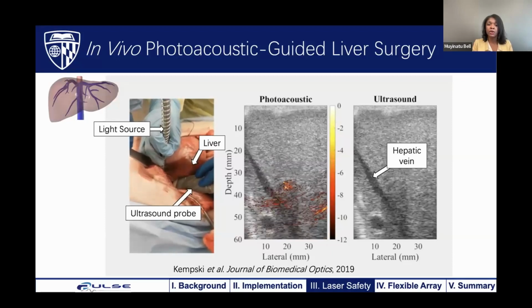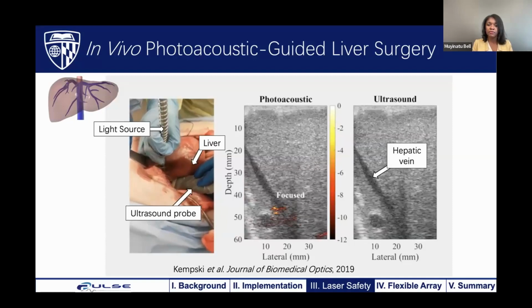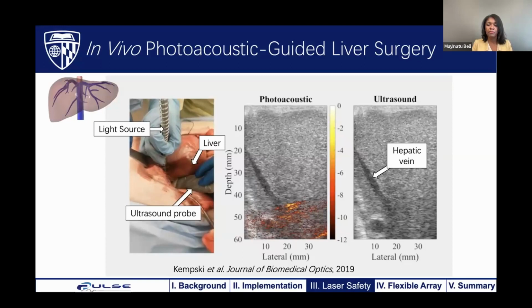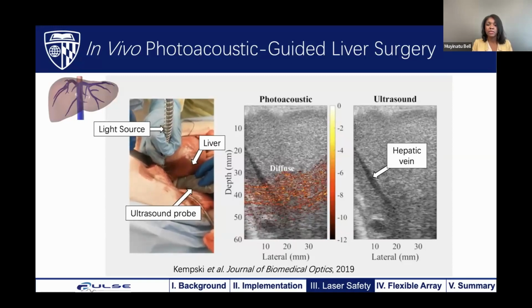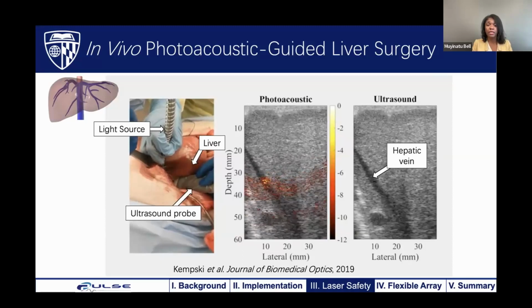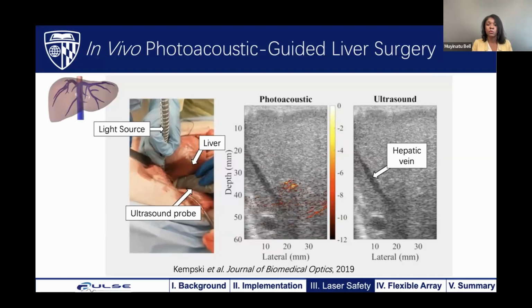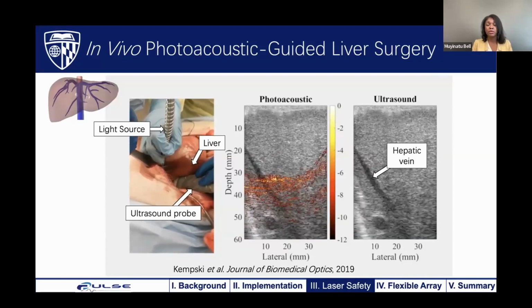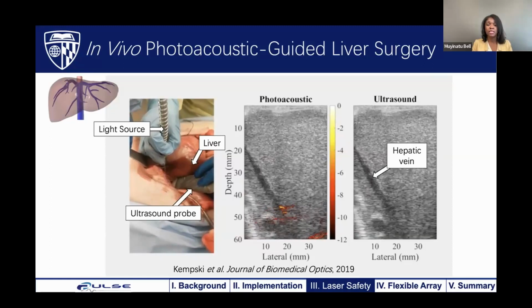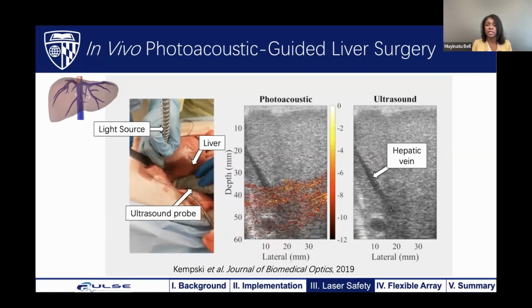We could do that. Or if we want to make a cut and injure this vessel so that we could proceed with our treatment and avoid excessive bleeding and prepare for excessive bleeding, we can have that additional information where the vessel is located relative to the tooltip, and we would not be able to know that exact information with just purely an ultrasound probe or purely a Doppler method.